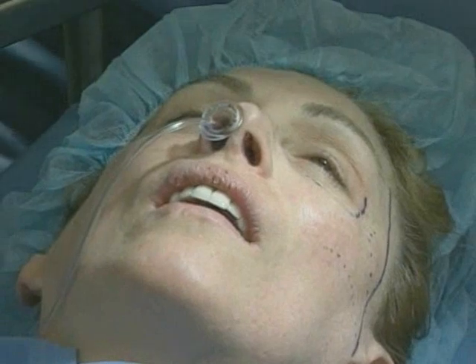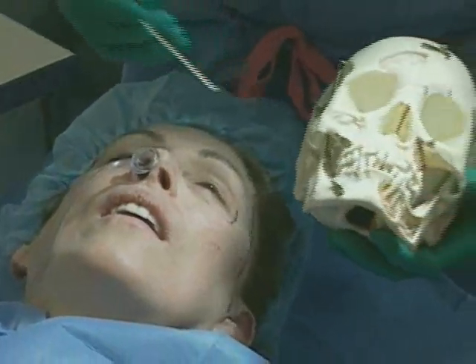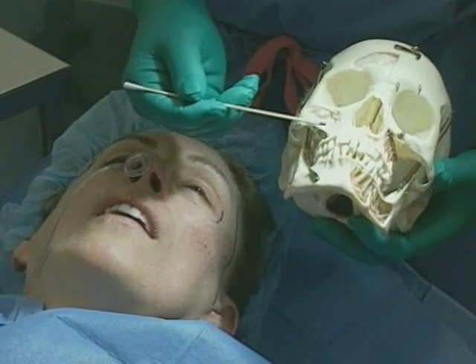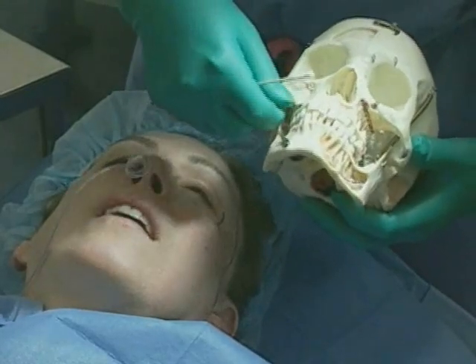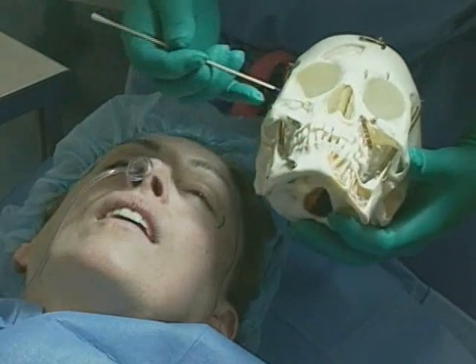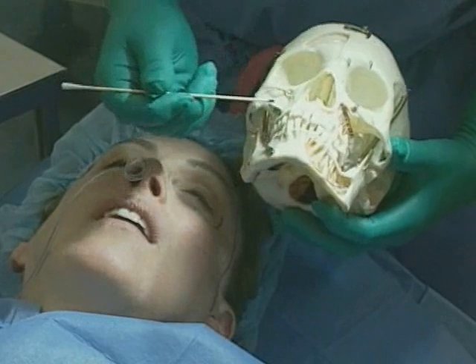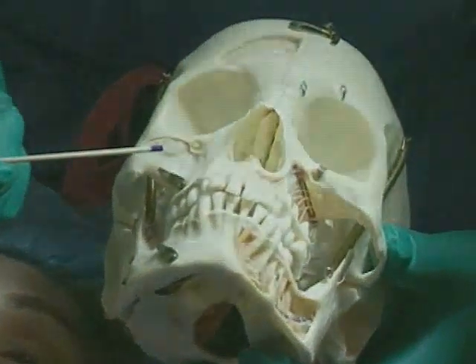If we think of our anatomy, it's really pretty simple. What we're doing is dissecting down and elevating the periosteum over the frontal part of the maxilla, which is, as you can see, the anterior wall of the maxillary sinus. We know that our infraorbital nerve is located in the midpupillary line, as we can see here. So when we're dissecting, we'll use a blunt dissection technique to help protect any injury to this nerve and elevate up to the point where we identify the nerve.